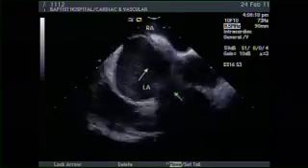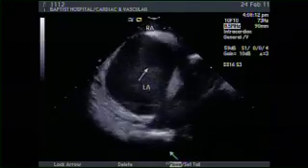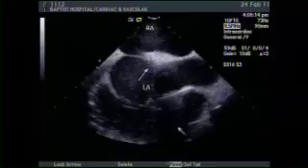Okay, Rocky. All right. So you see, can you show the fluoroscopy images, please? So you see the catheter inside the heart on the right side. So I'm pulling back the catheter. You can see it right here. And I'm guiding myself by the ICE images and also the fluoroscopy images, and I cross through the hole into the left side of the heart.